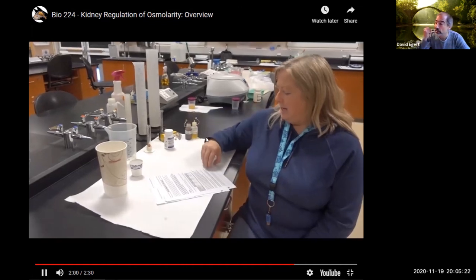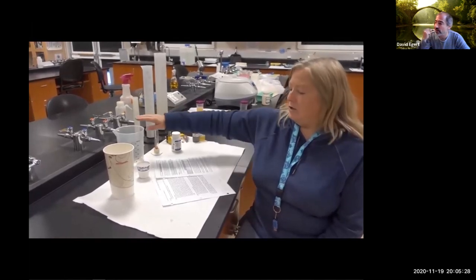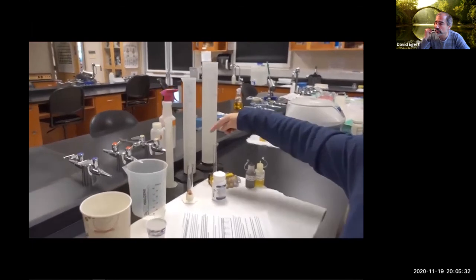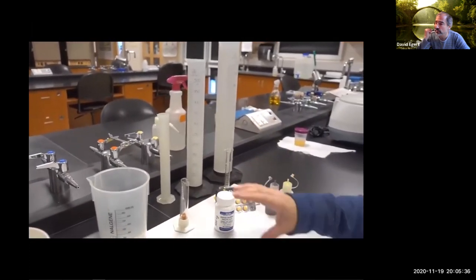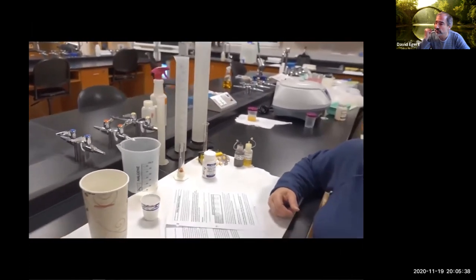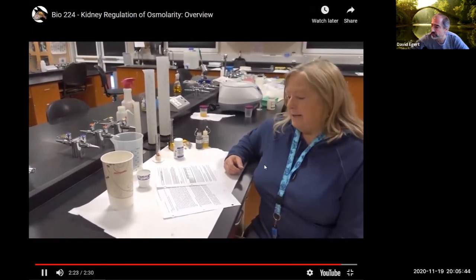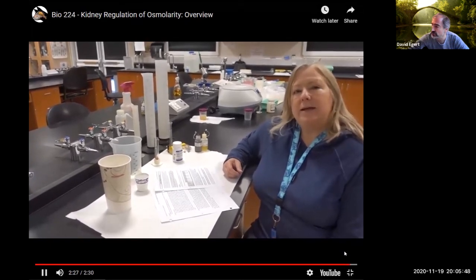They are going to take various analyses on their samples. They're going to measure their volume, and we have different sizes of graduated cylinders to hopefully match closely the overall volume of urine that was collected every 30 minutes. Specific gravity, we'll show that in just a second, and also sodium chloride concentration, we'll show that next.